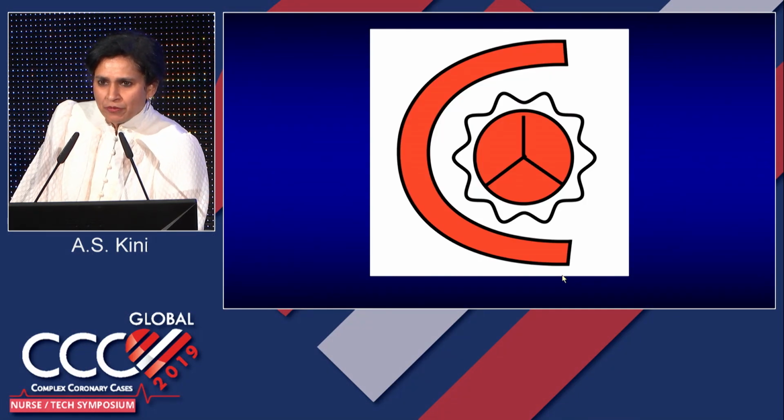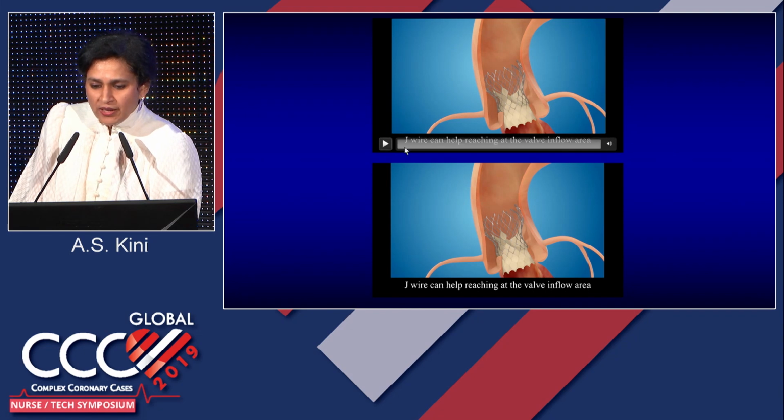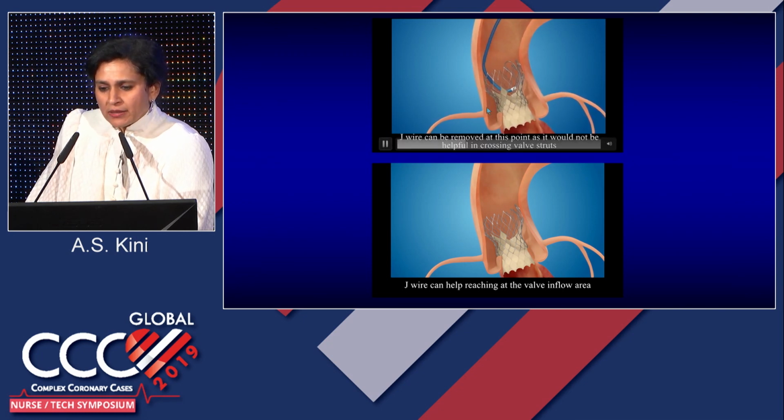And this is the app which we made based on the review article that I did. You can see here, this is an animation showing how you can engage the coronary arteries once you place the TAVR valve. Because there have been case reports where patients came back and they did not know how to engage, and embolized the TAVR valve. So it's very important you know exactly how to engage after the TAVR valve.